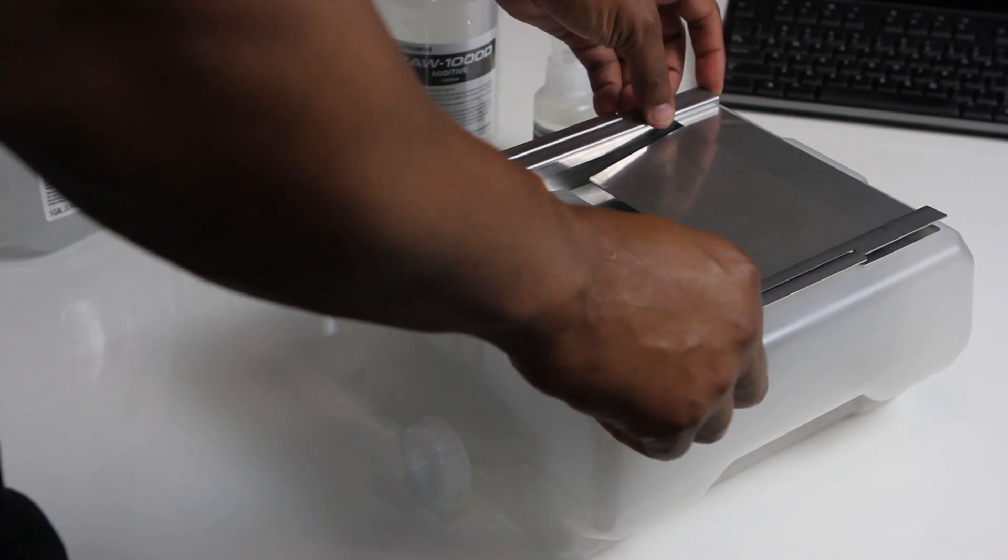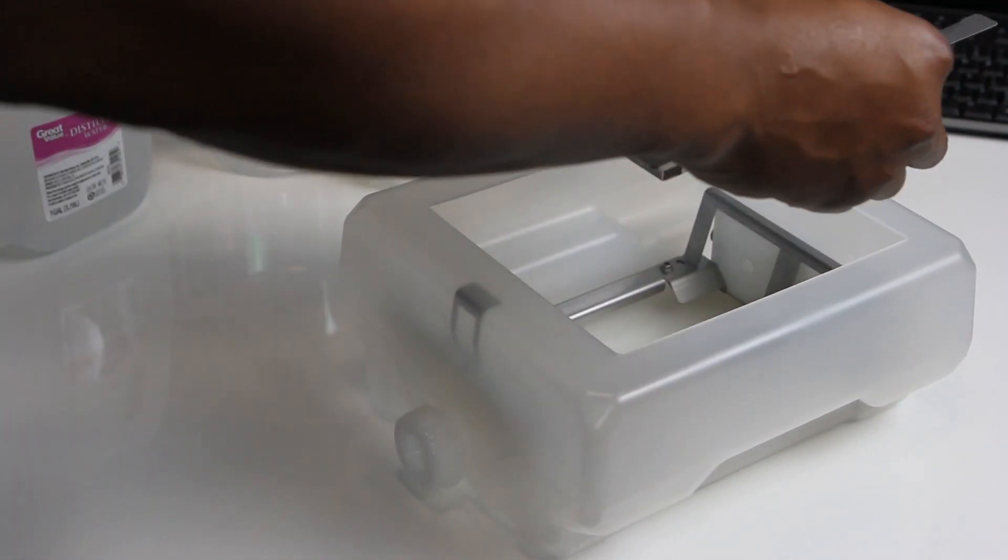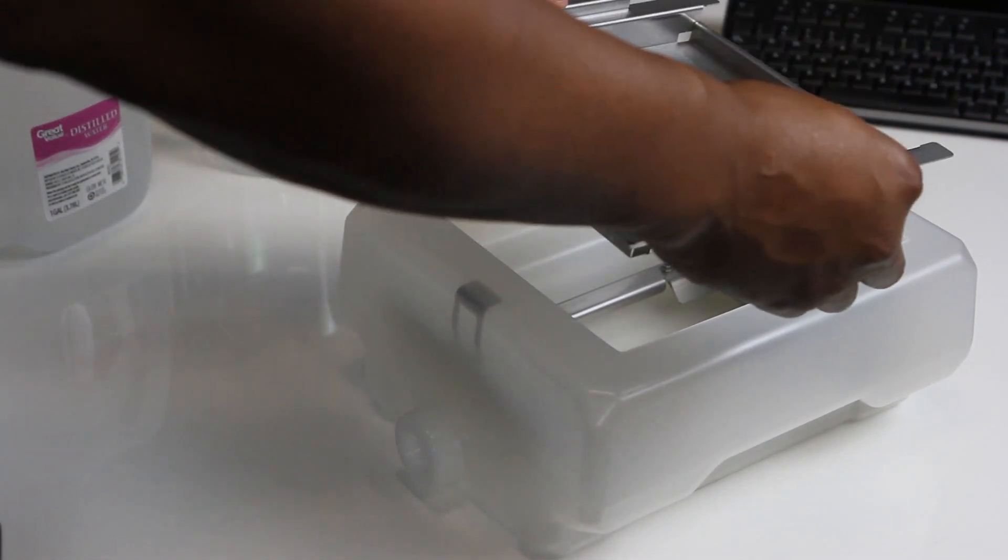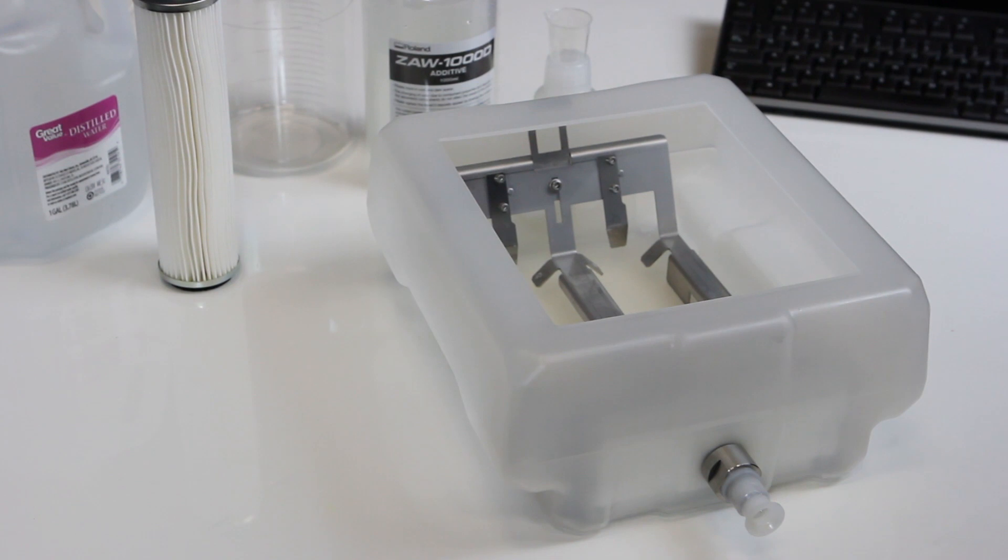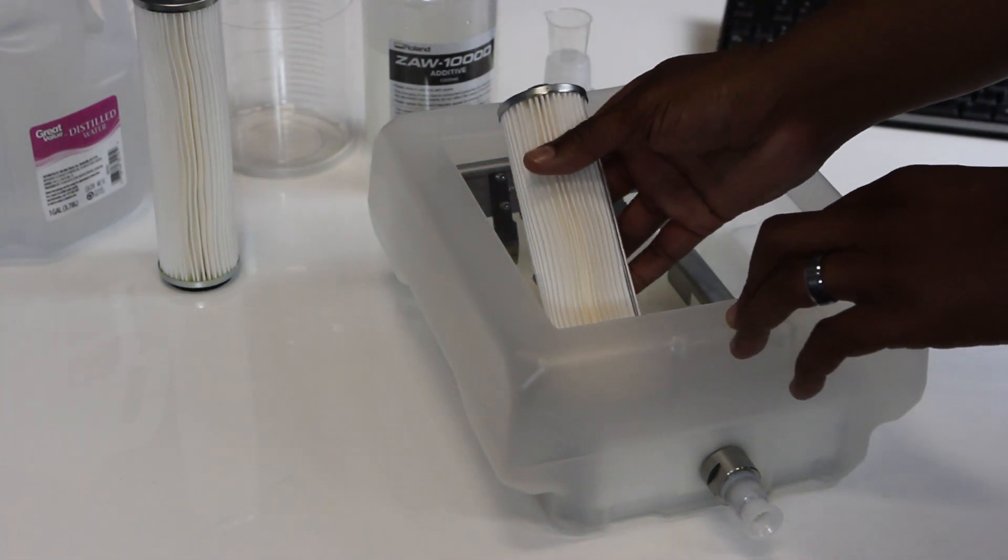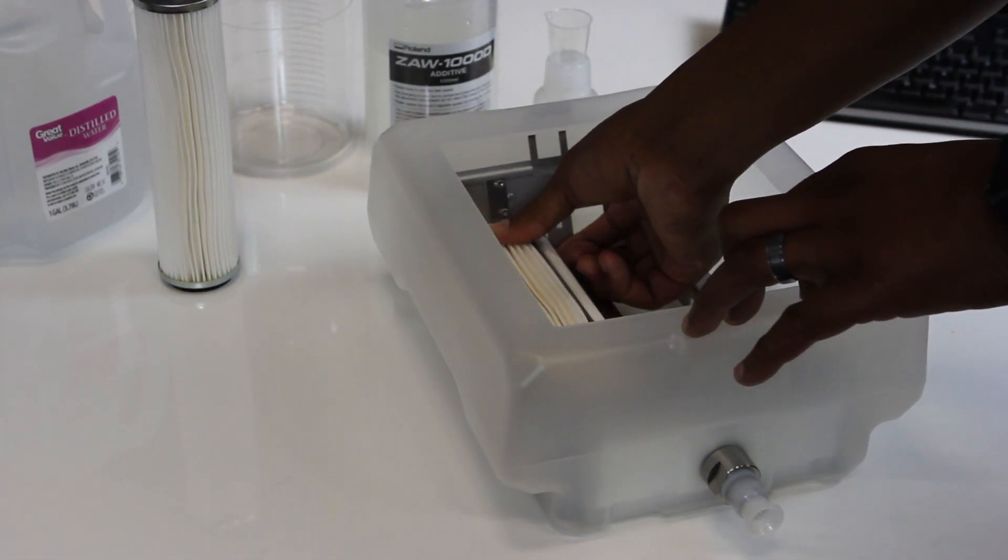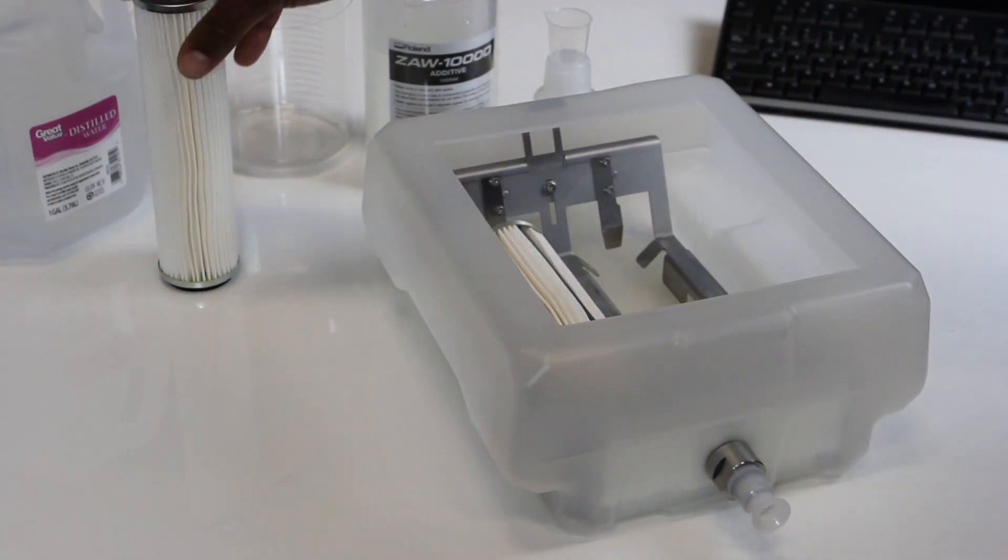Remove the tray lid, then remove the tray. Insert the coolant filters. Be sure the protrusion of the filter is facing the side of the tank with the coolant tap.